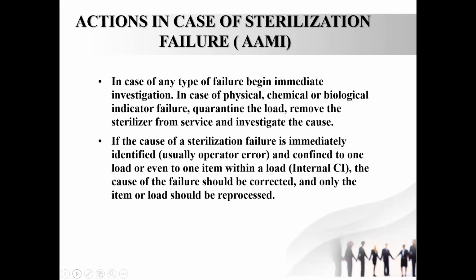If you see your physical, chemical, or biological indicators have failed, quarantine the load. That means keep it on the side. Don't issue it. Remove the sterilizer from service. That means that sterilizer also cannot be used till you make the full investigation.